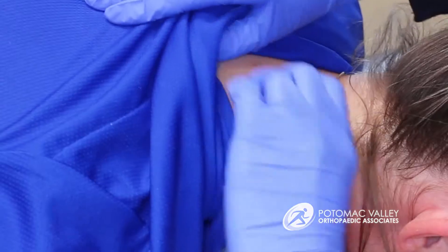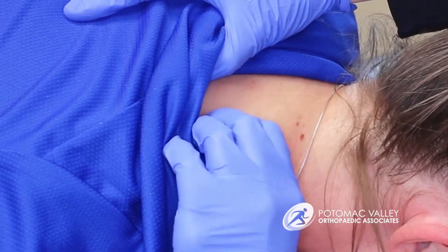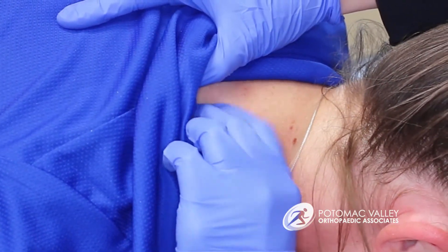We use our fingers to palpate or feel around for adhesions or trigger points. We're looking for something that is painful to the touch where we can feel that adhesion under our fingers, but also maybe reproduces the familiar pain that the patient is used to experiencing. That's how we know we're on the right area.